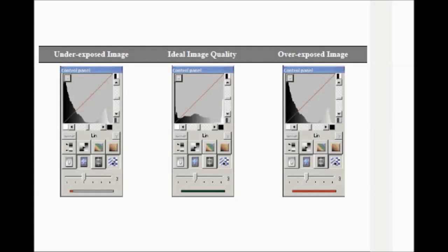Check the image and whether the quality is satisfactory. The ideal image quality is indicated by a full green bar in the control panel. Underexposed or overexposed images are indicated by a partial or full red bar.